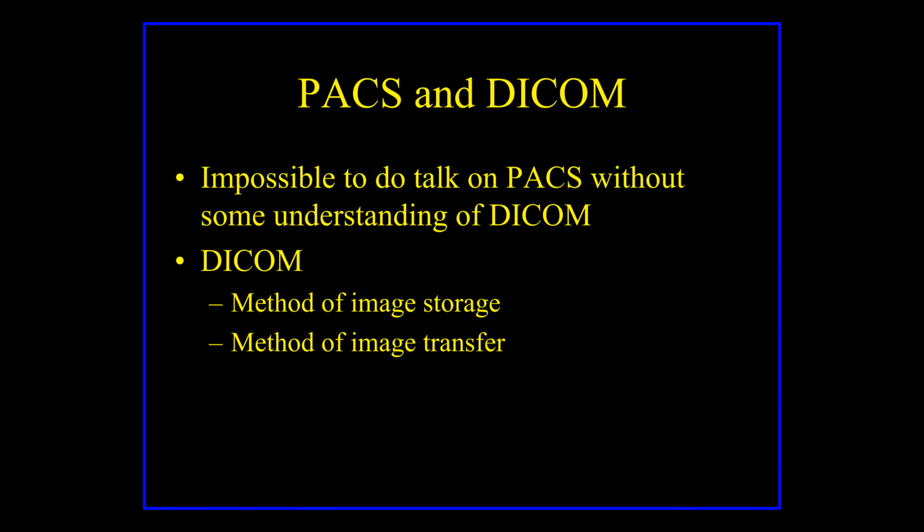Okay, PACS and DICOM. So where does DICOM come in? DICOM is another acronym that stands for Digital Imaging and Communications in Medicine. The acronym's not really right, but they couldn't put the I instead of the O, because then it would be a different word and that wouldn't be too good. So they made it DICOM. Anyway, we won't go into that.